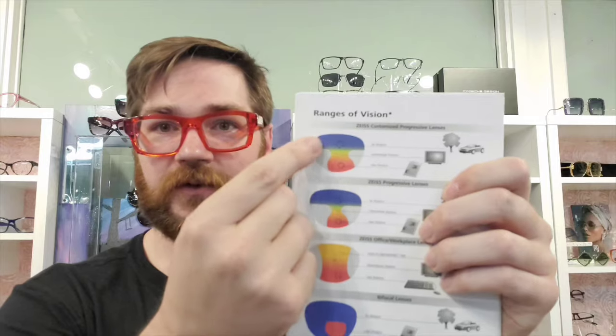With progressive lenses, the blue part of the lens is the far distance zone. The majority of the lens opens up at the top, and as you look down below the pupil, the power gradually increases, giving you a near zone. That's the close-up reading area. In practice though, you often have to tilt your head down to access that part of the lens.